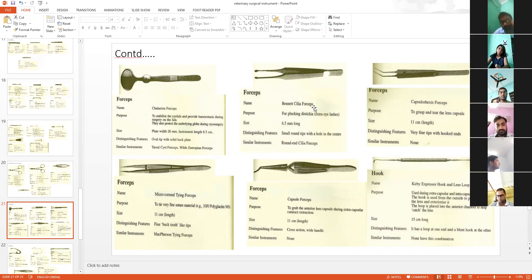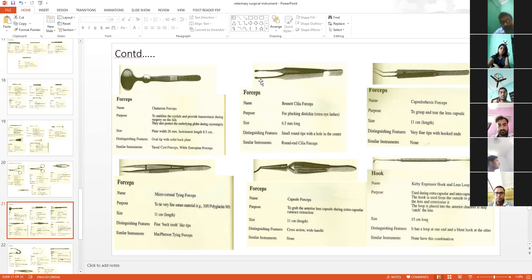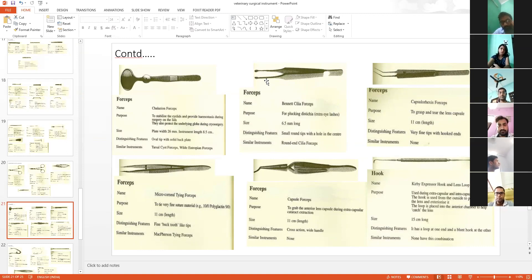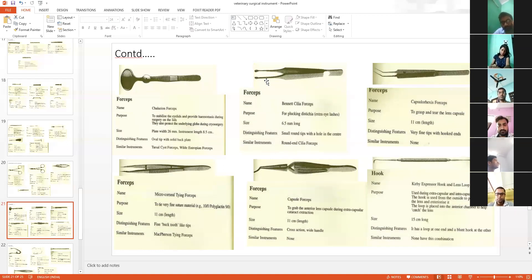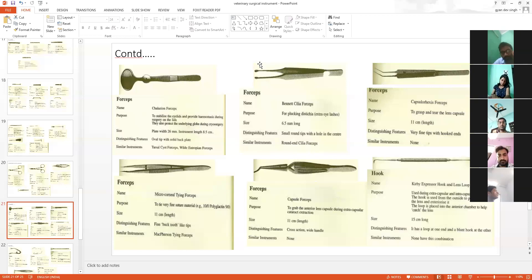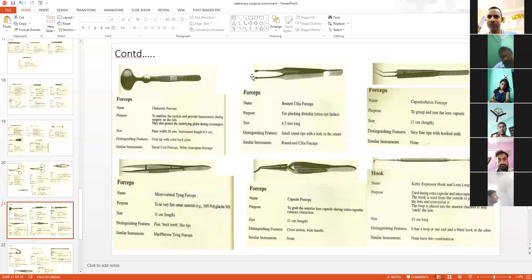These are Bennett's cilia forceps, used for the removal of ectopic cilia. When there is inversion of cilia inside the cornea, continuous irritation leads to inflammation of the eye. For the removal of that ectopic cilia, we use these Bennett's cilia forceps.